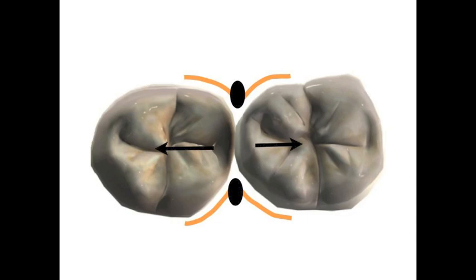In order to achieve a tight, forcible contact when utilizing a resin composite, we need to separate the teeth over time. This separation compensates for the thickness of the matrix band. To separate the teeth, we need to use the interproximal wedge and a separating ring.